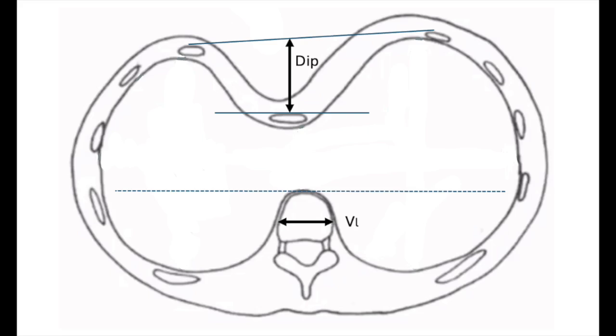That makes 4 indices of severity in inspiration and expiration. And I think this will allow us to really determine who benefits and doesn't from surgery. So I hope that's okay for you. They're actually quite quick to measure, as I'll show you when I go through some examples. And I hope I have your support measuring these, hopefully in inspiration and expiration.